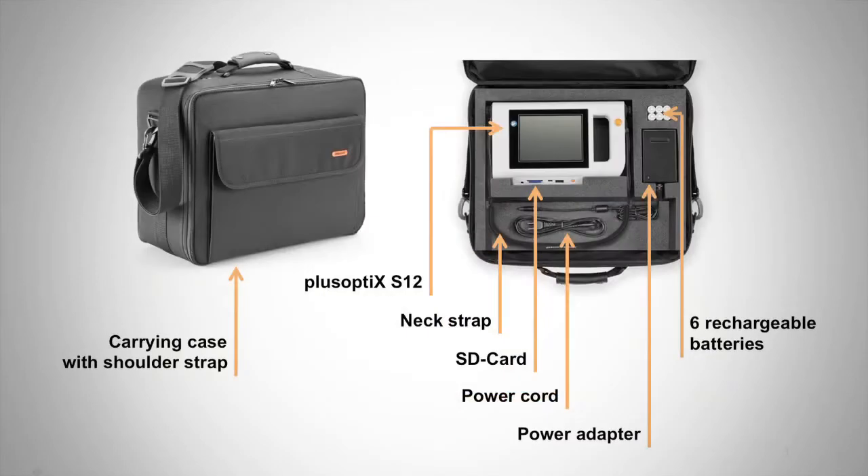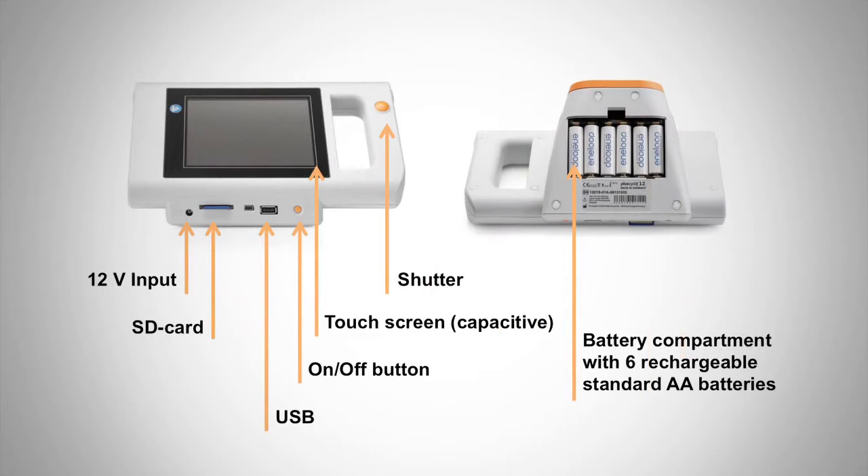Your Plus Optics S12 testing kit should include the following: a carrying case with shoulder strap, the Plus Optics S12 device, a neck strap, an SD card, a power cord and power adapter, and six rechargeable batteries.